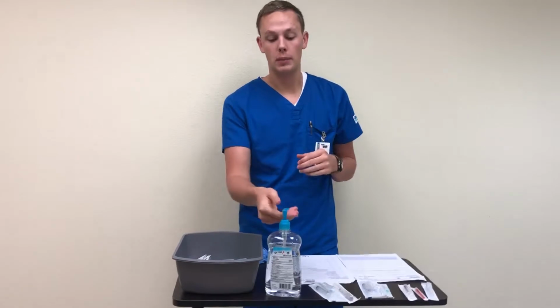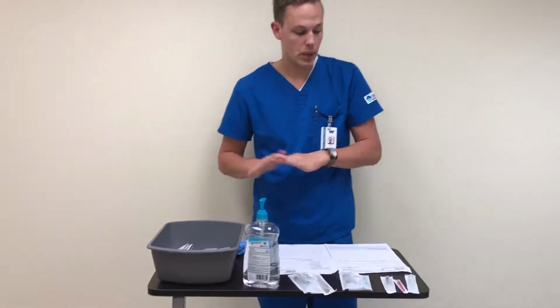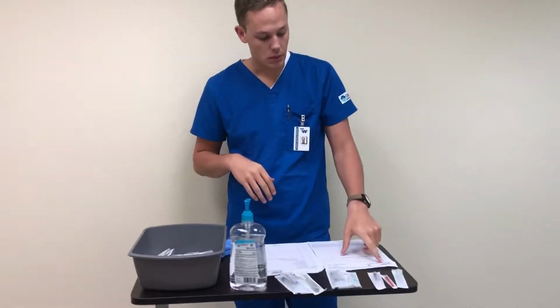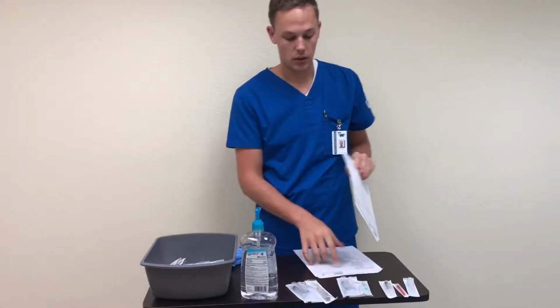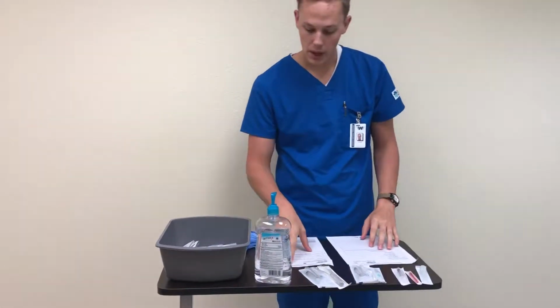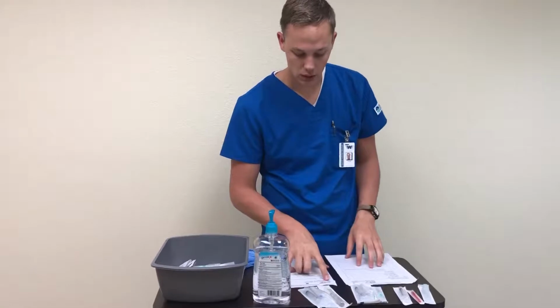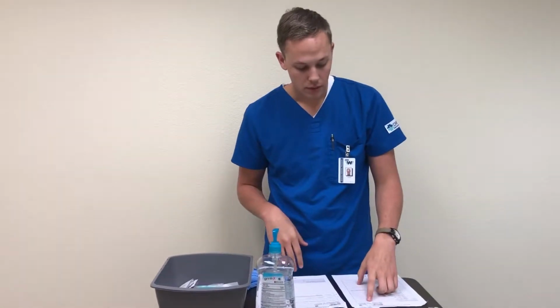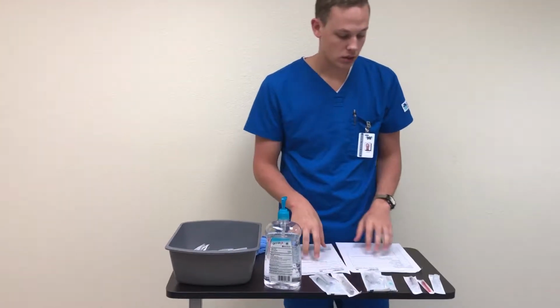So the first step is I'm in the med room and I'm going to perform hand hygiene, and then I'm going to start looking at my medication records as well as my provider orders for my patient who's going to receive these medications. So my patient is Shirley Koss, 54-year-old female, and that's what it's telling me on the provider orders. And so on my med record, that's also what it says, Shirley Koss, 54-year-old female, as well as a date of birth of 5/14/1964, and that matches as well.